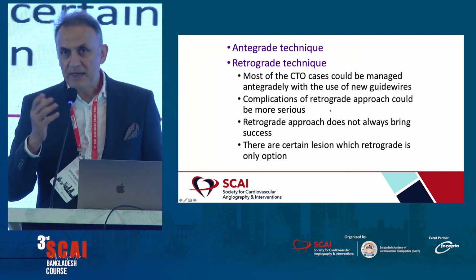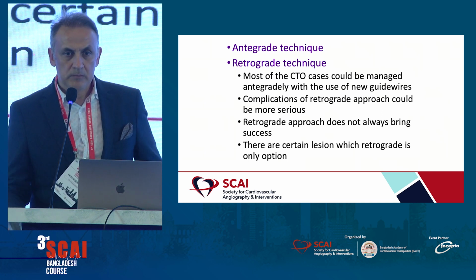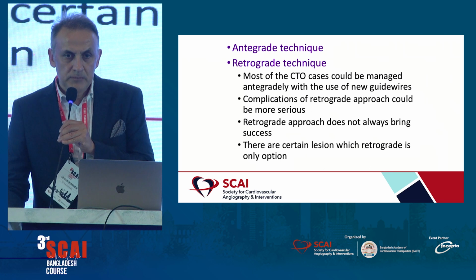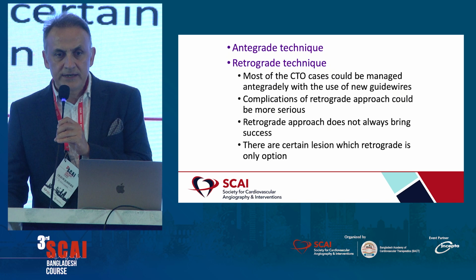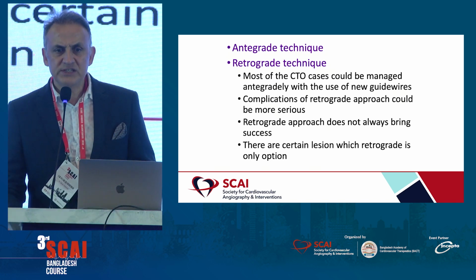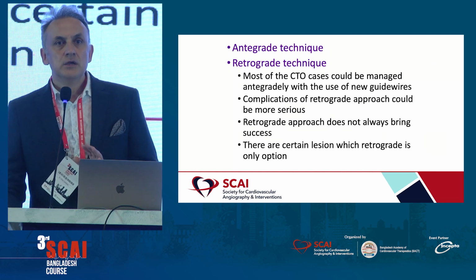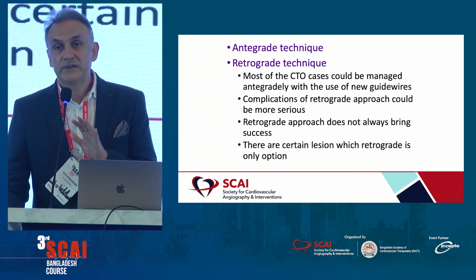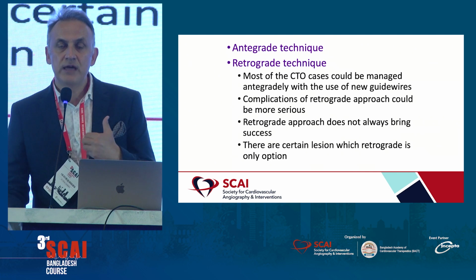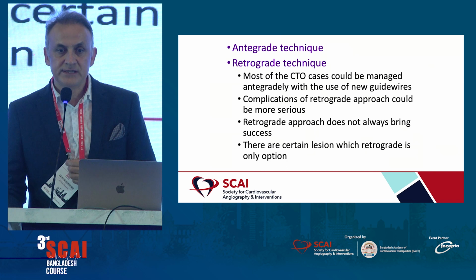So basically, we have two techniques. Yes, antegrade, which my colleague talked about very nicely. Thank you for the great talk. And also, we do have the retrograde technique. Most CTO cases could be managed antegradely with the use of new guide wires. So first of all, we should be aware that most cases we can open antegradely. So we have to have nice antegrade technique, as mentioned earlier, like parallel wire techniques or other techniques.